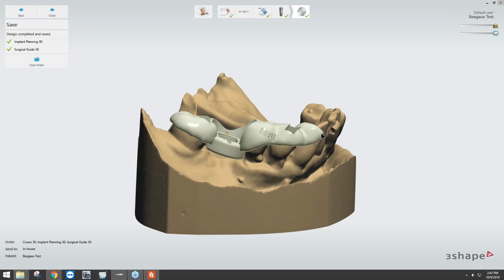I have another question about the legal requirements. This software has that report that it generates at the end, and it's expected for a dental technician to give that off to the doctor or the surgeon to sign off on the implant placement. Most labs will come up with a waiver on top of that to make sure that it's been waived to the doctor's responsibility for confirming the placement. That's what kind of allows labs to do this planning process instead of just going to the doctors.